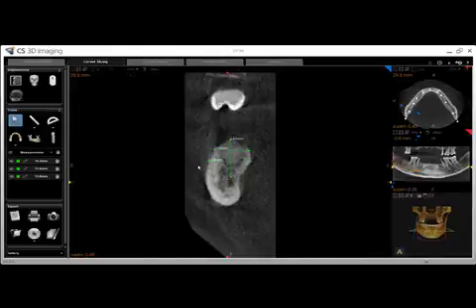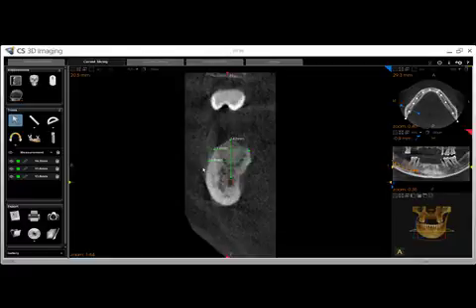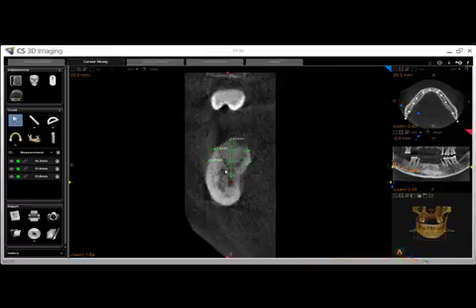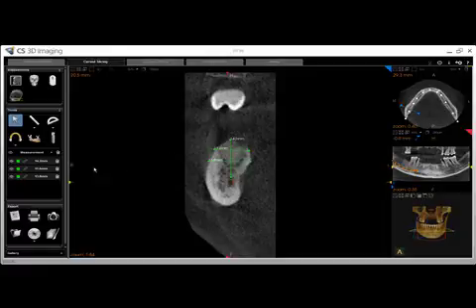Another important measurement to consider is bone density, indicated by the number in the lower right-hand gray section of the screen. This number constantly changes as you move your mouse through the bone in the region of interest. Notice the very high levels of density in the cortical bone with lower density in the medullary bone. You may delete your measurements by clicking the remove button next to each one.